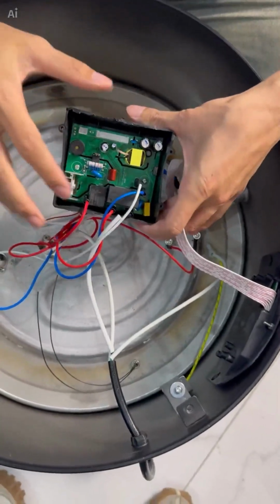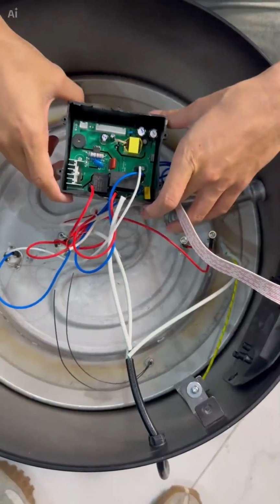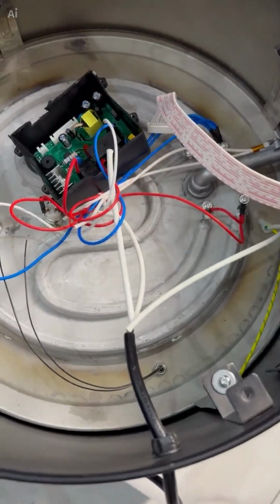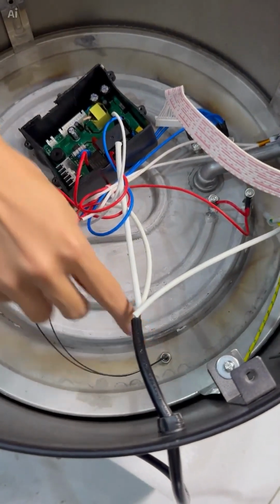We have completed assembling this new power circuit board into this box, the black box. Alright, in this step we need to remove the temperature probe and then prepare a hex wrench to take it off.